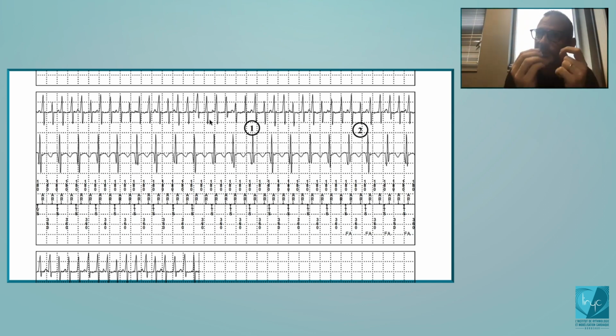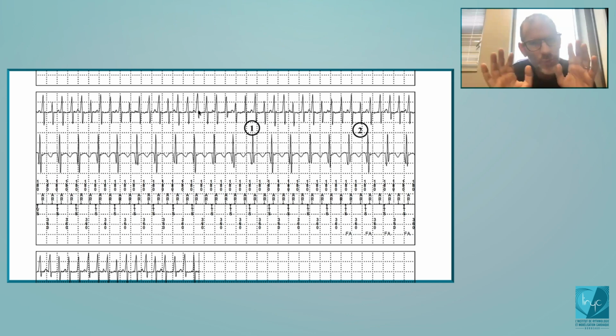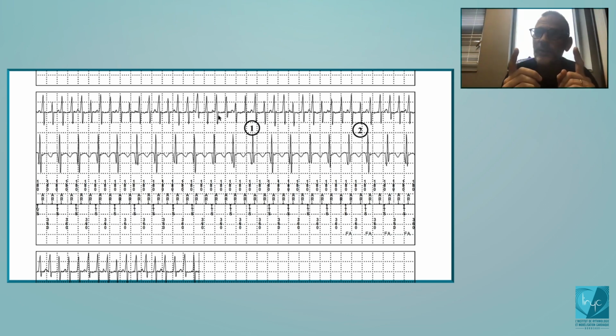So there is a criterion. The second criterion analyzed will be, is there oversensing at the level of the atrial channel, explaining why there would be a false diagnosis of fast atrial rate? Here the device will search for, I will not give you all the details, sequences with long, short at the level of the atrial channel.